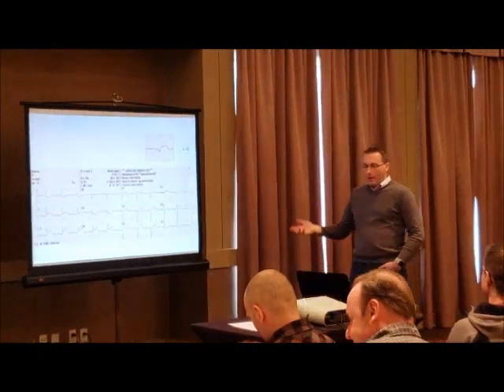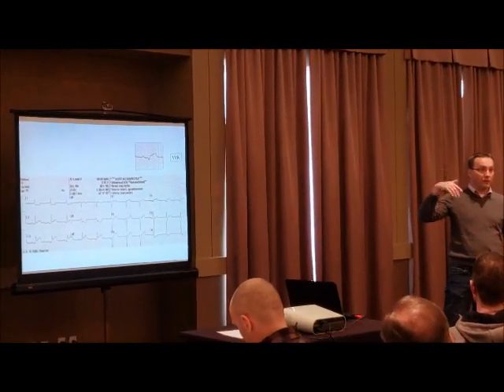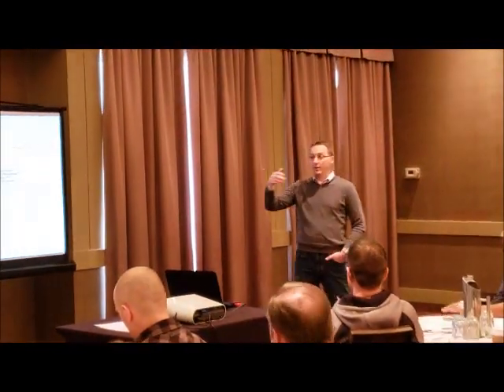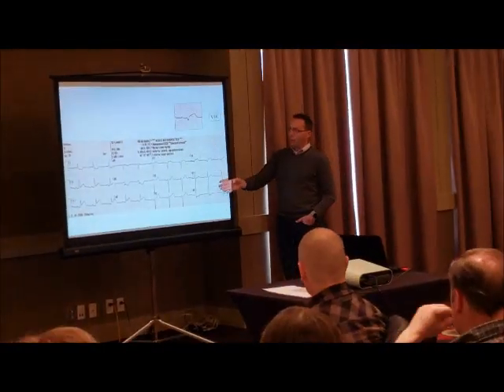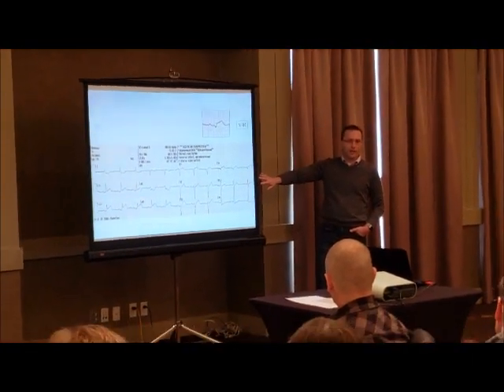So I asked my friend, the unit secretary, can you print out a 12-lead ECG from the desk there, because they can print remotely, and it prints out at the printer behind the nurse's station. So you can see this right here, when we've identified right ventricular infarction. I'm going to show you the next ECG now that the patient's blood pressure has bottomed out.